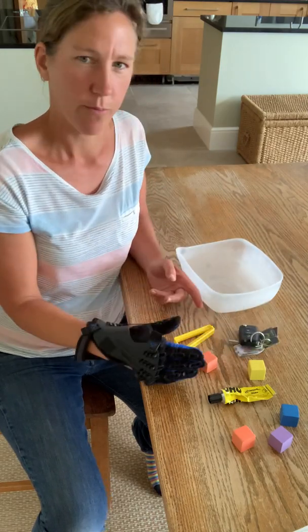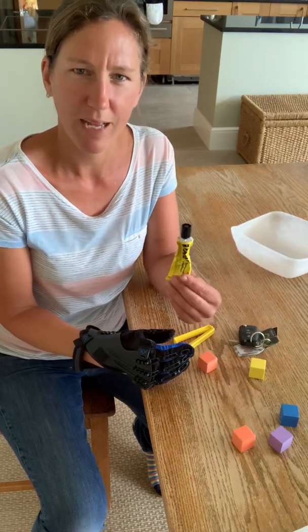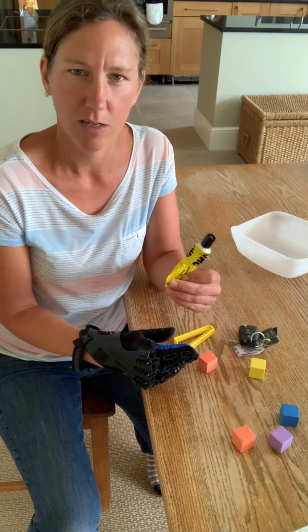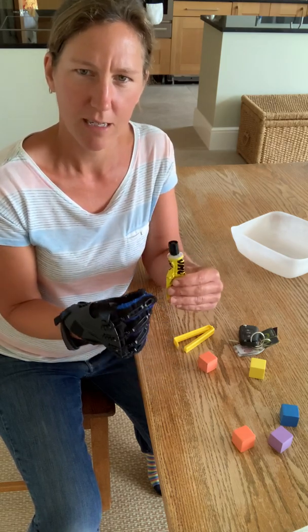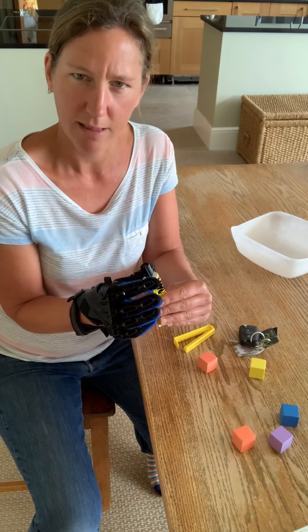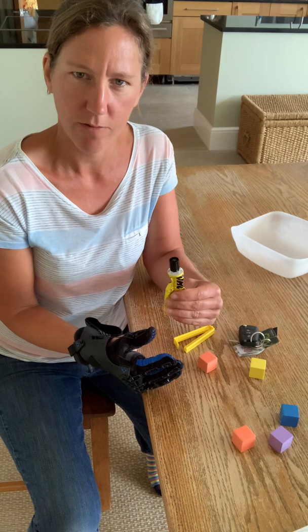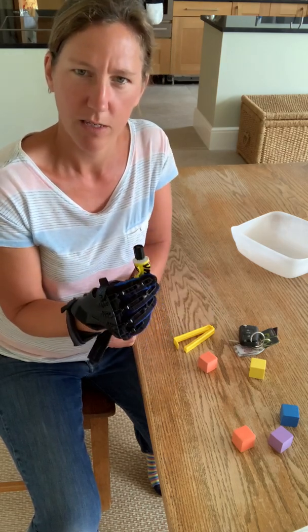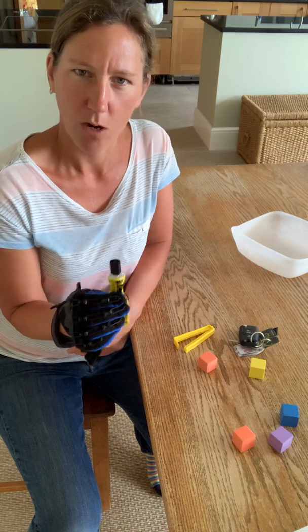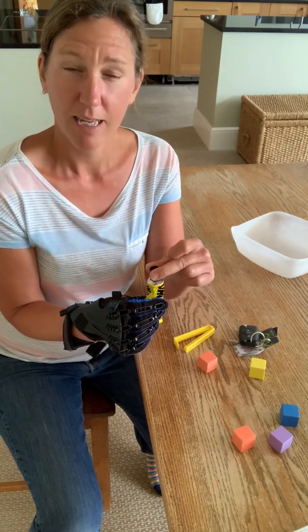It might also be with each item, so I've got some glue, but it could be anything like toothpaste with a lid on. Either hold it with your unaffected hand, and this is the more challenging way, and then practice trying to take the lid off with your SaeboGlove. Or if that's too difficult, swap over. So your SaeboGlove is going to hold the tube whilst you then can unfasten.